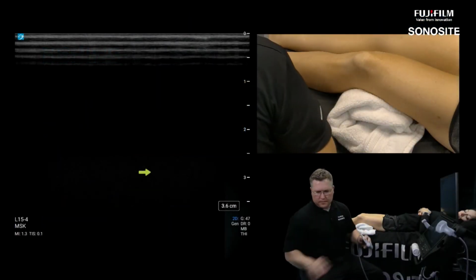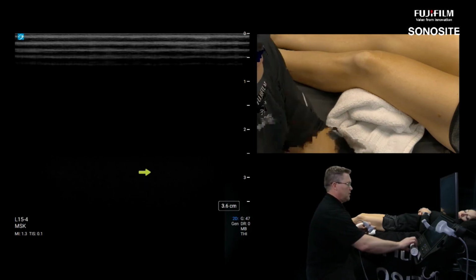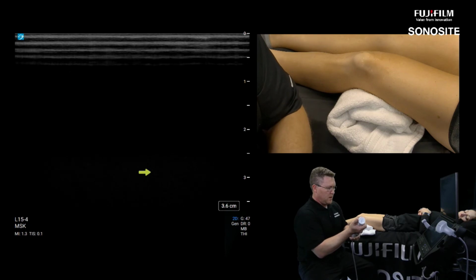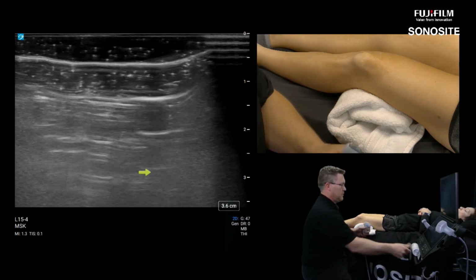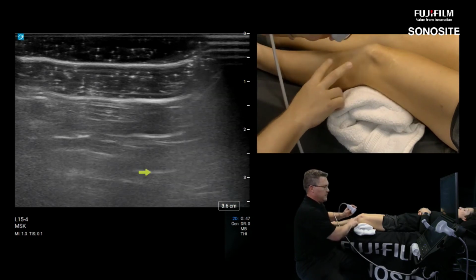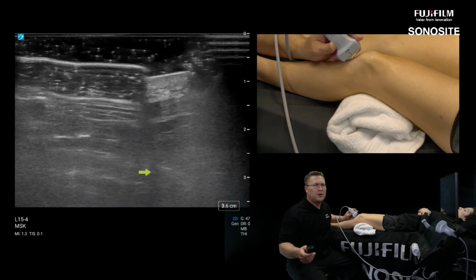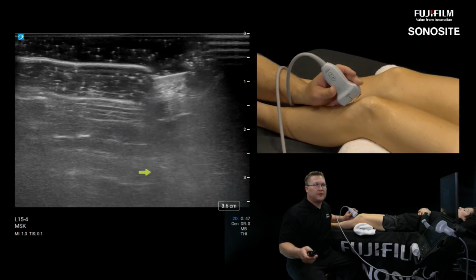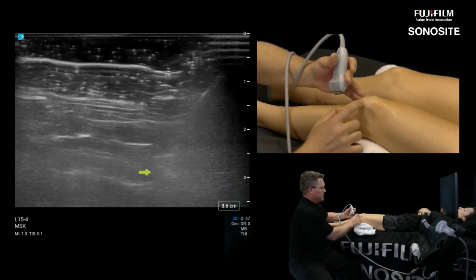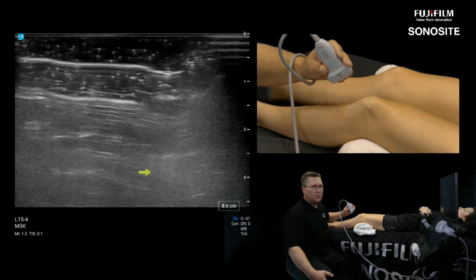All right. Make sure our microphone's on. Good audio. And as mentioned before, medial and lateral scanning, a little bit different, a little more difficult, but infrapatellar, my favorite part to teach, basically because it's so easy, especially for beginners, to understand the concepts of MSK ultrasound. We have just the easiest longitudinally arranged fibers there are in the whole body, easy to reach on yourself if you have a machine at home.